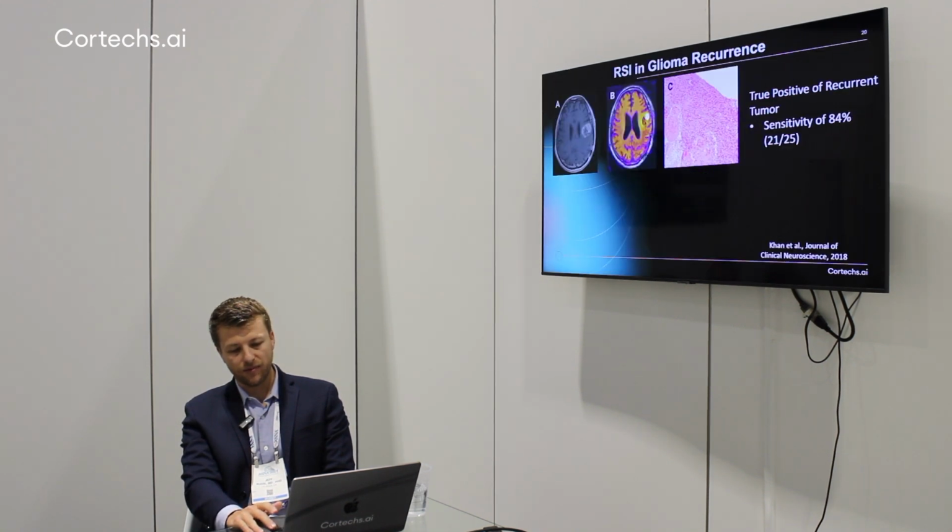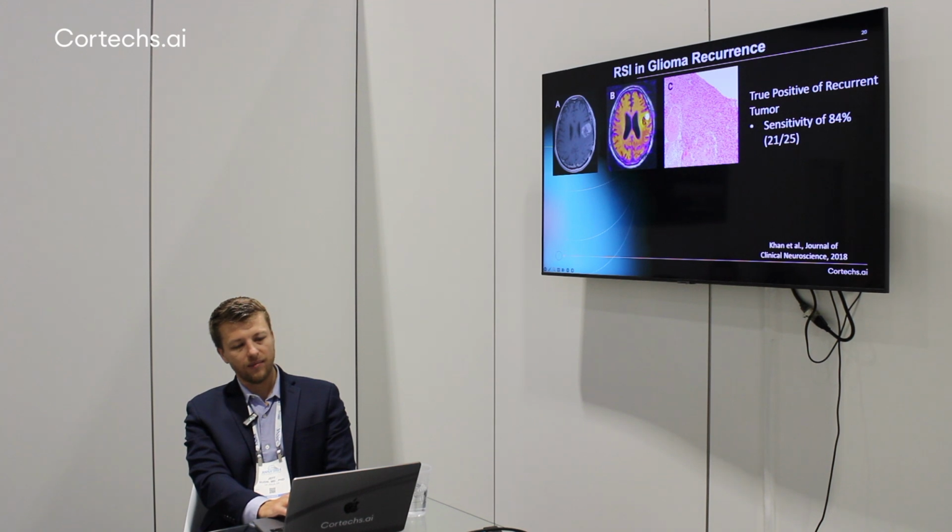But what I did at UCSD, I want to tell you a little more, is take it the next step further. And sorry, just first a little bit of background. Prior to me going to UCSD, there was some work on RSI that had been used in a few case studies showing how it can be sensitive in detecting recurrent disease.